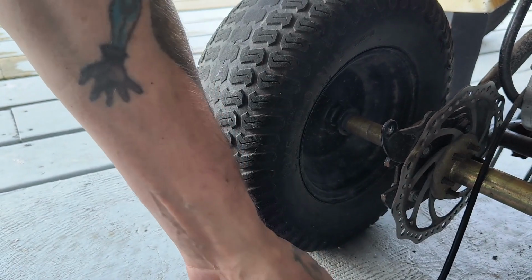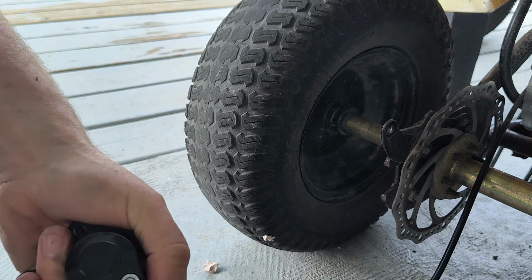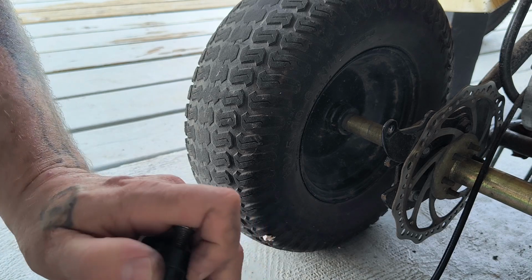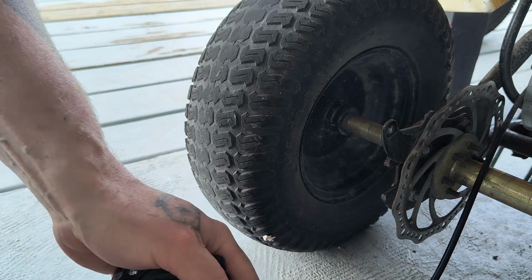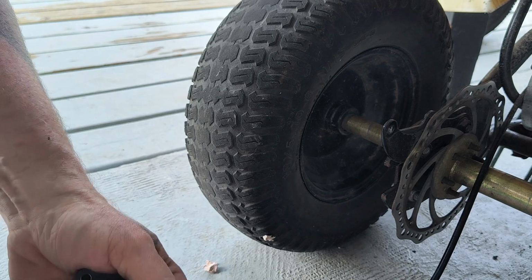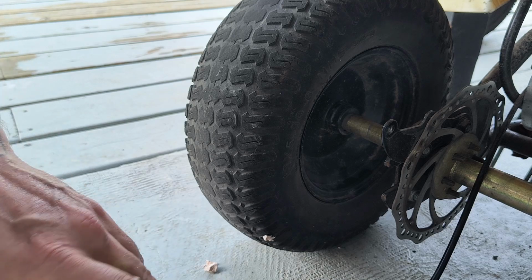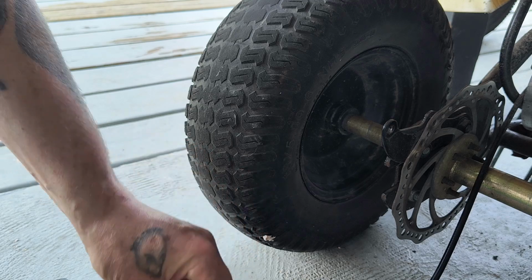There. Get these pads out and put those on. Might keep this black cap. Alternate colors and pieces a little bit, make it look a little more ramshackle, which is my taste. Both the same.